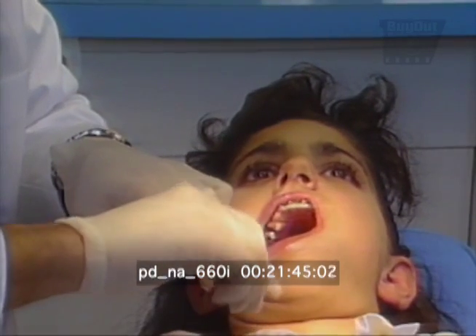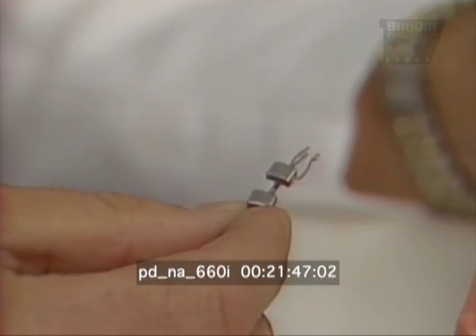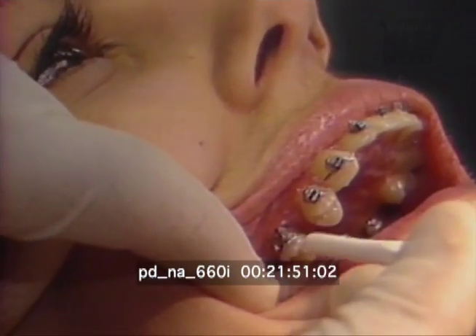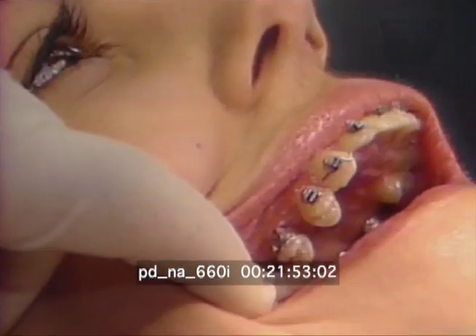Each month, the orthodontist tightens the wires so the magnets keep working. Now that the molar has moved back, we are starting to retract the second bicuspid.